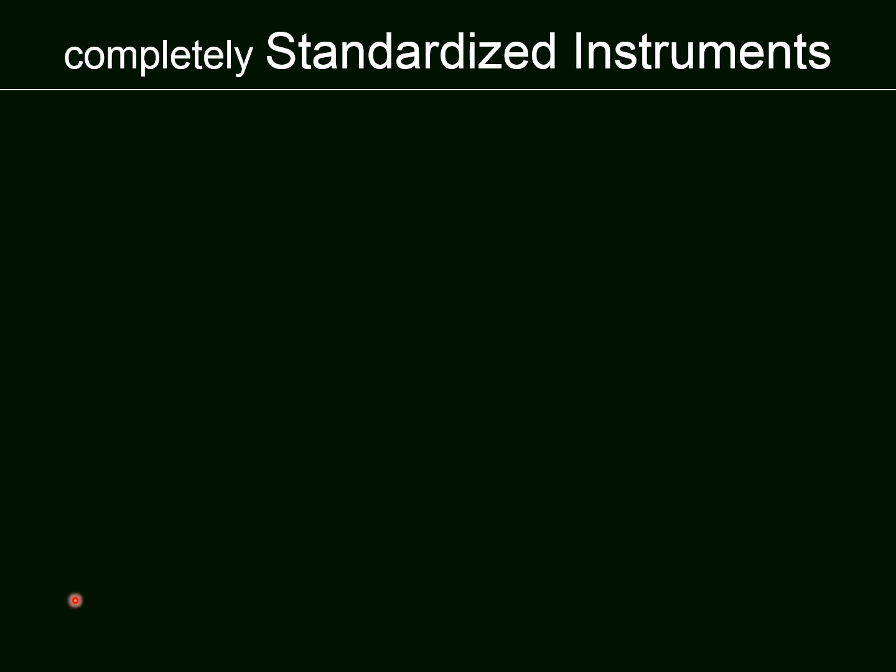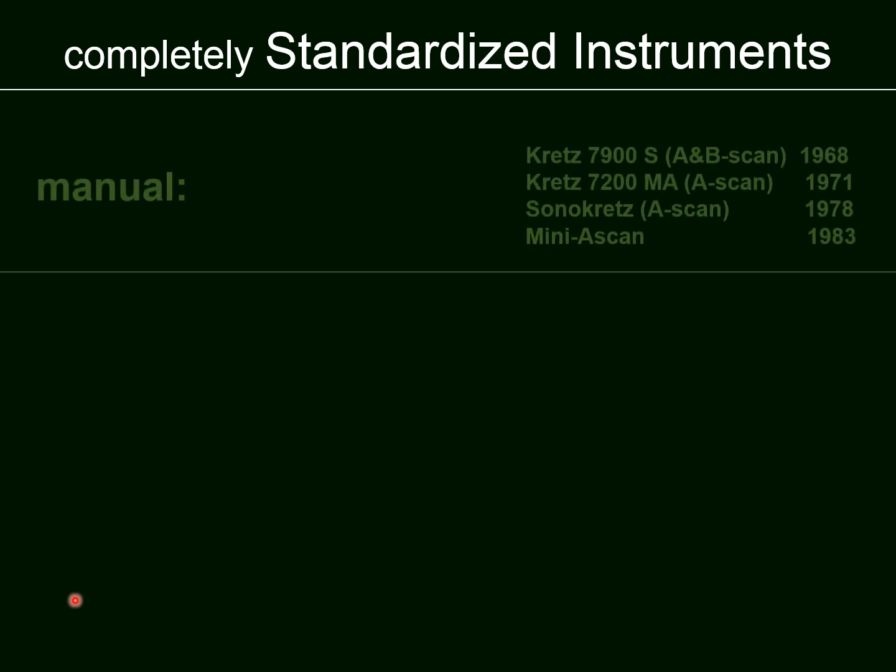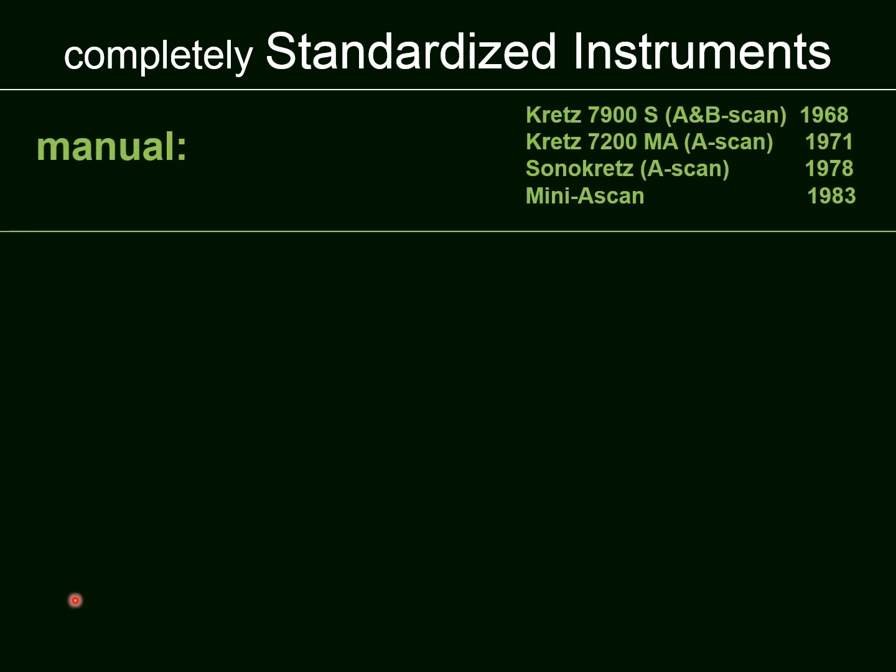Finally, a list of all the completely standardized instruments in the history of echography. The first units were handled manually.